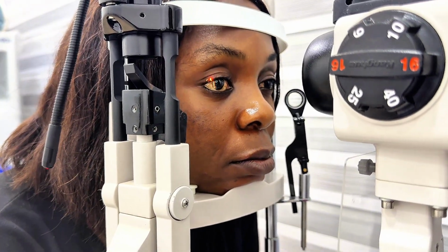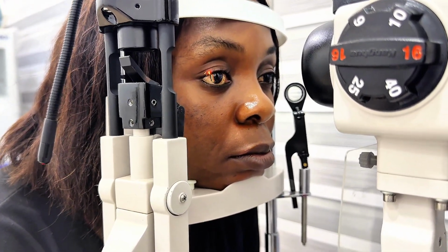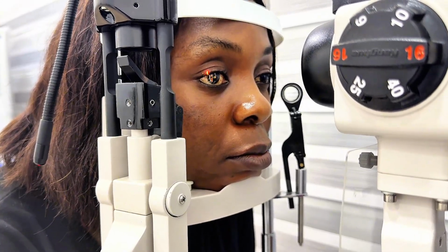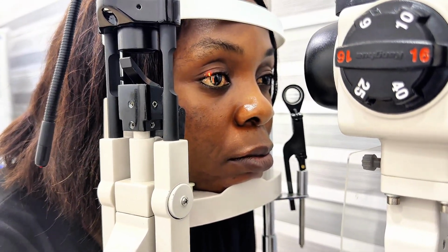When we're done with that, we move to the nasal limbus of our patient. So when you are done estimating the depth of the anterior chamber on the right eye, you move to the left eye and you do the same thing. Remember, you place it at the temporal limbus, after which you move it to the nasal limbus.